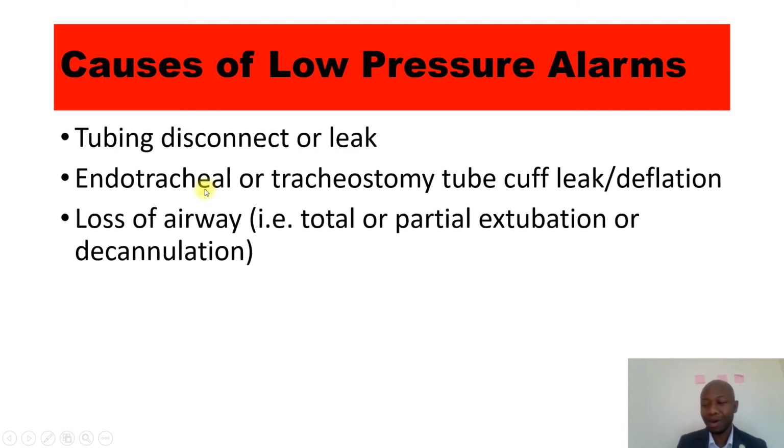Okay, you remember on my water bottle I said if there is any leak, it's easy for the ventilator to push that air into the system. However, it doesn't mean that the air is going into the patient's airway, and yes, it will be pushed at a lower pressure than it's supposed to be, or that is already set on the ventilator.